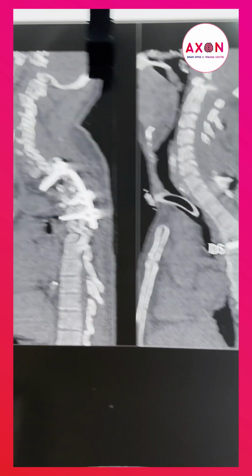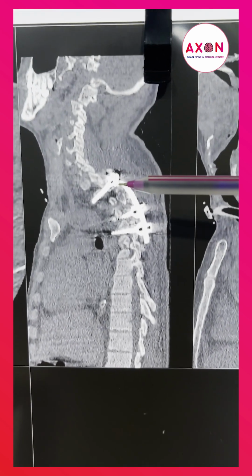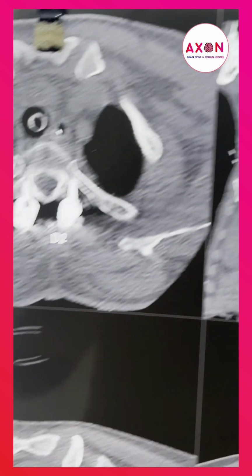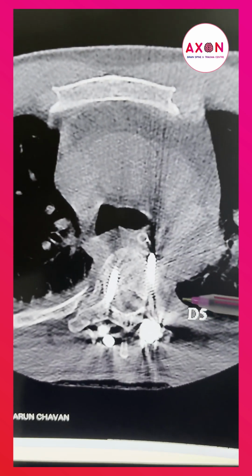Now this is again a sagittal image of the post-operative scan. You can see this is the D2 screw, this is the D4 screw, this is the D5 screw. Let's have an axial view one by one. So start from the lower, D5.